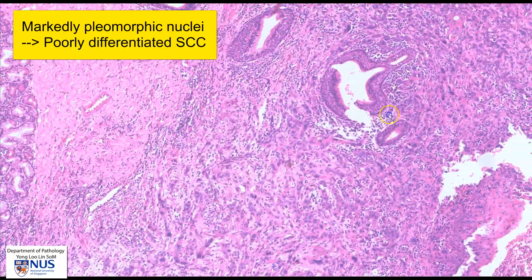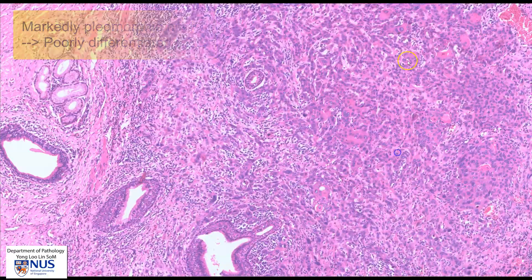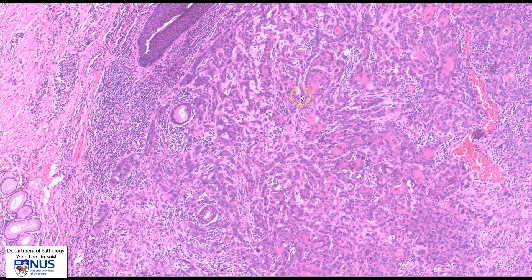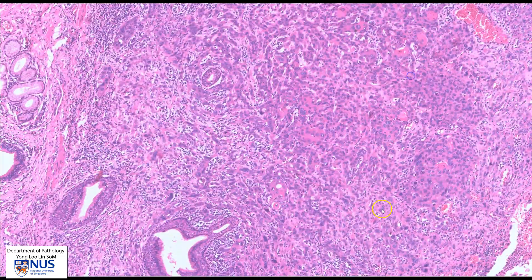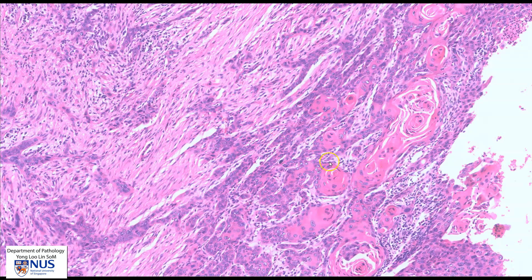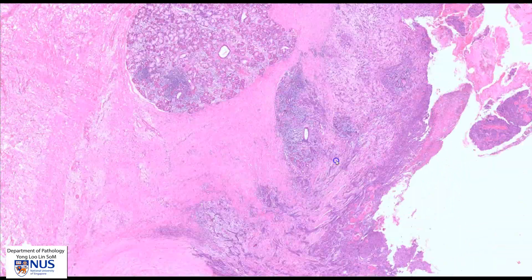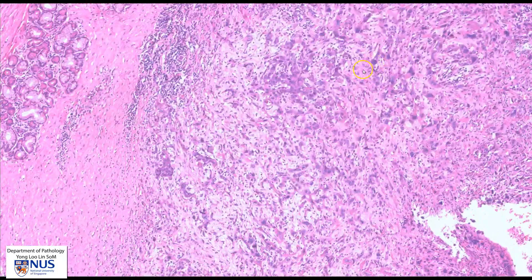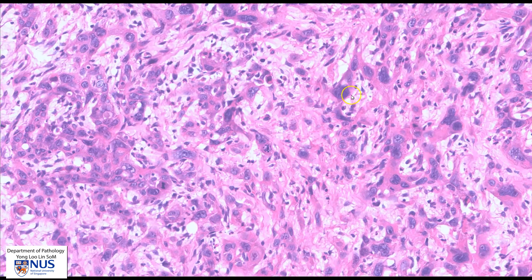So we have a range of differentiation here. In the better differentiated areas, we can still recognize this squamous appearance with keratin pearls, and over here we can also see very well-formed keratin pearls. However, in other areas, such as here, we can see that there is more pronounced nuclear pleomorphism, and in these areas the tumor would be considered poorly differentiated.